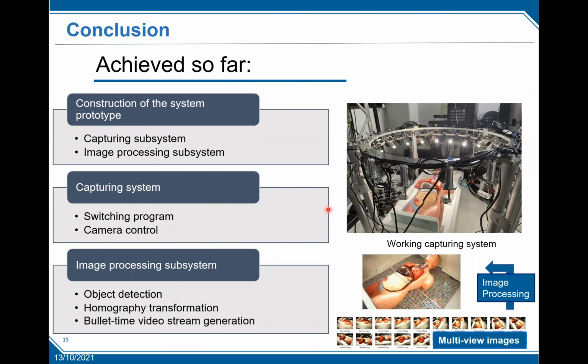And here finally comes the conclusion. First, we constructed the proposed system prototype for the capturing system in order to decide the type of camera module, LED spotlight, and computer. We designed several comparison experiments and compared the cameras, lights, and computers of several brands.